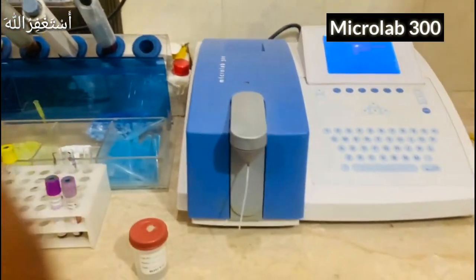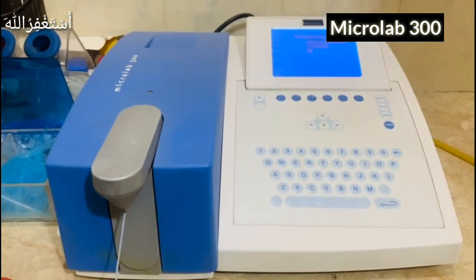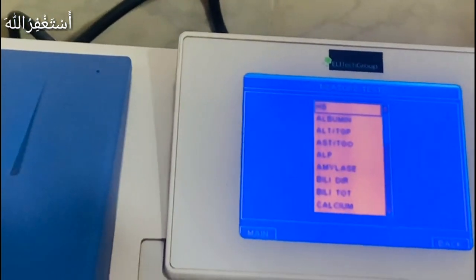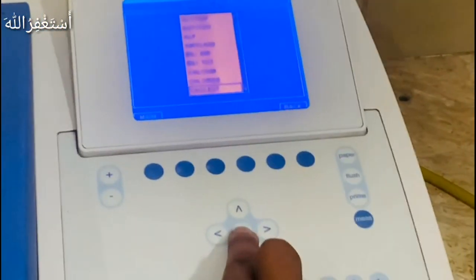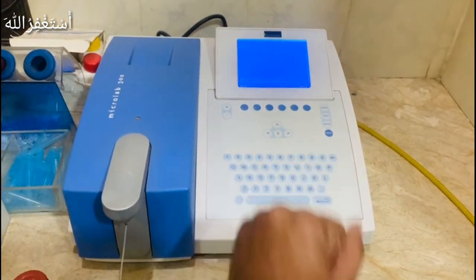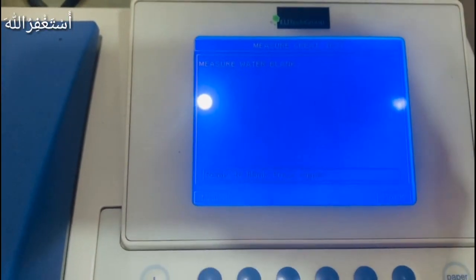This is our Microlab machine. We have to take the reading from the machine. We need to select creatinine from the menu and press the appropriate button to proceed with the test.